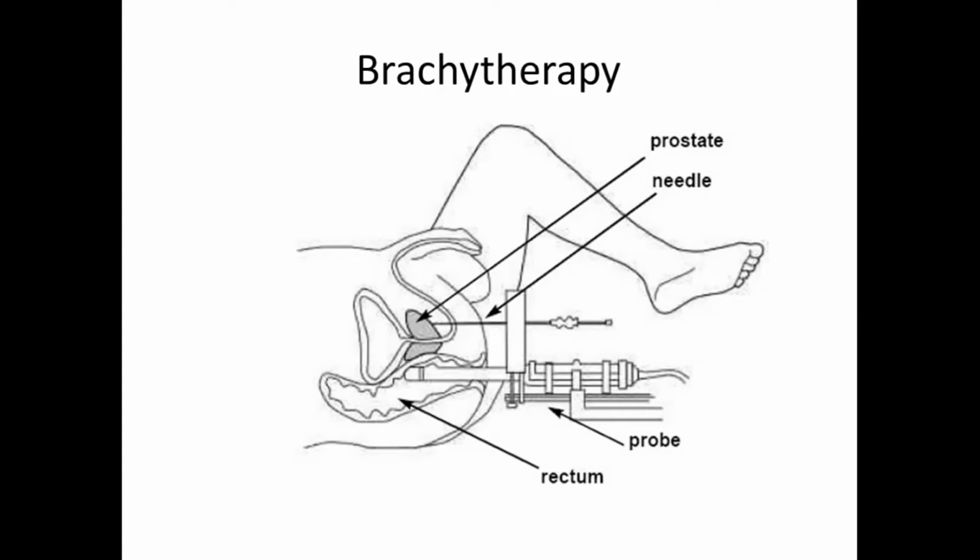So they have a spinal anaesthetic to put them to sleep, just like an epidural. And then they have a light general anaesthetic as well, because it's a relatively quick procedure, about 45 minutes. So we don't want a deep anaesthetic because we want them to wake up and recover pretty quickly. And then when people are asleep, they get put into this undignified position where your legs are up and out the way into some stirrups.